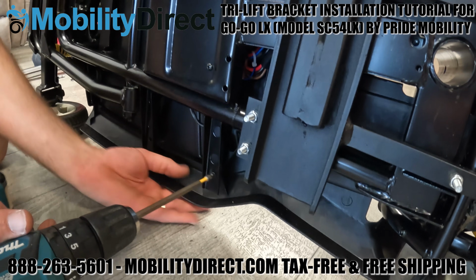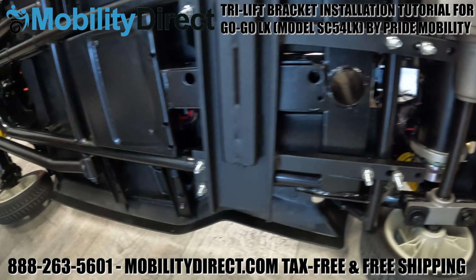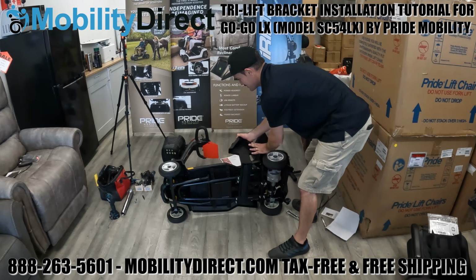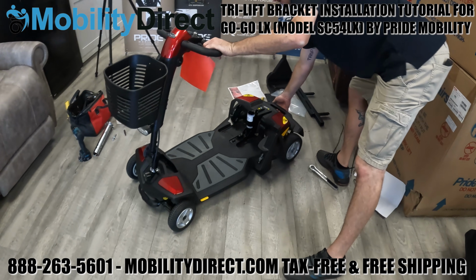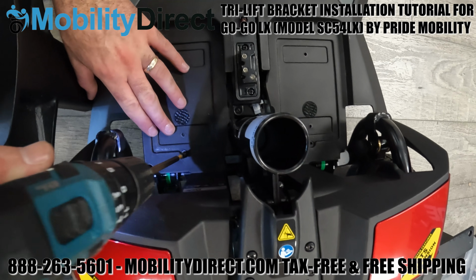The floorboard does have metal threaded holes for those screws, and just take a look here at the configuration. Make sure that your setup is exactly the same. So as you can see, we've tipped it back over, and that triangle bracket's on the left side, as mentioned. So we're going to go ahead and reinstall the rear 2 screws that go right underneath the battery cradle.